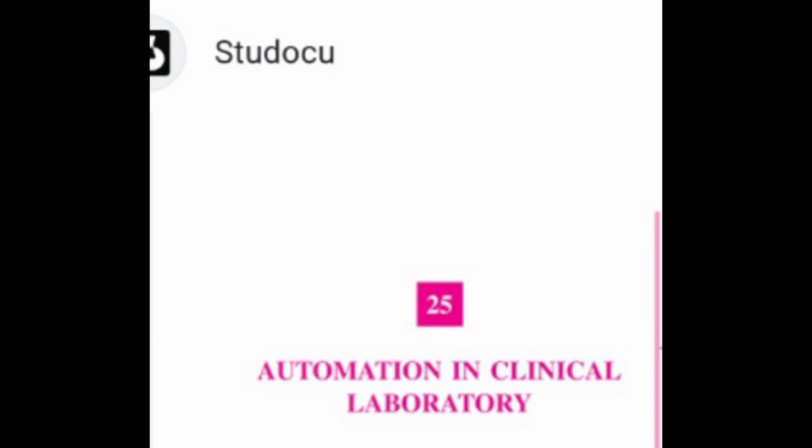Setting the unit is automatic with regard to wavelength, time and temperature. It is suitable for a small laboratory which has a sample load of less than 25 per day, or for batch analysis. In this type of instrument, the reagent mixture is mixed and fed automatically. A single reagent can be stored in the machine at a time, so a batch of a particular chemistry test can be performed automatically. Random access analyzer: more than one reagent can be stored in such a unit.